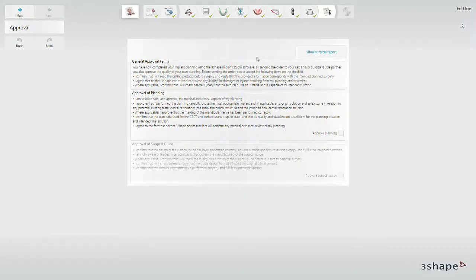In this video you will learn how to continue the prosthetics design for an edentulous case plan in 3-Shape Implant Studio.